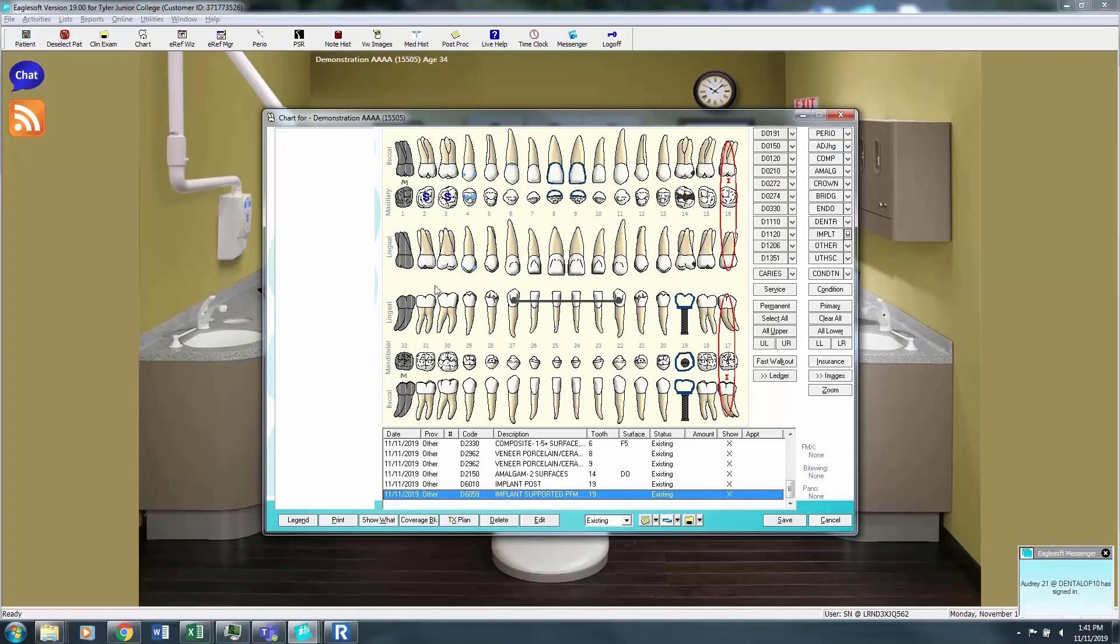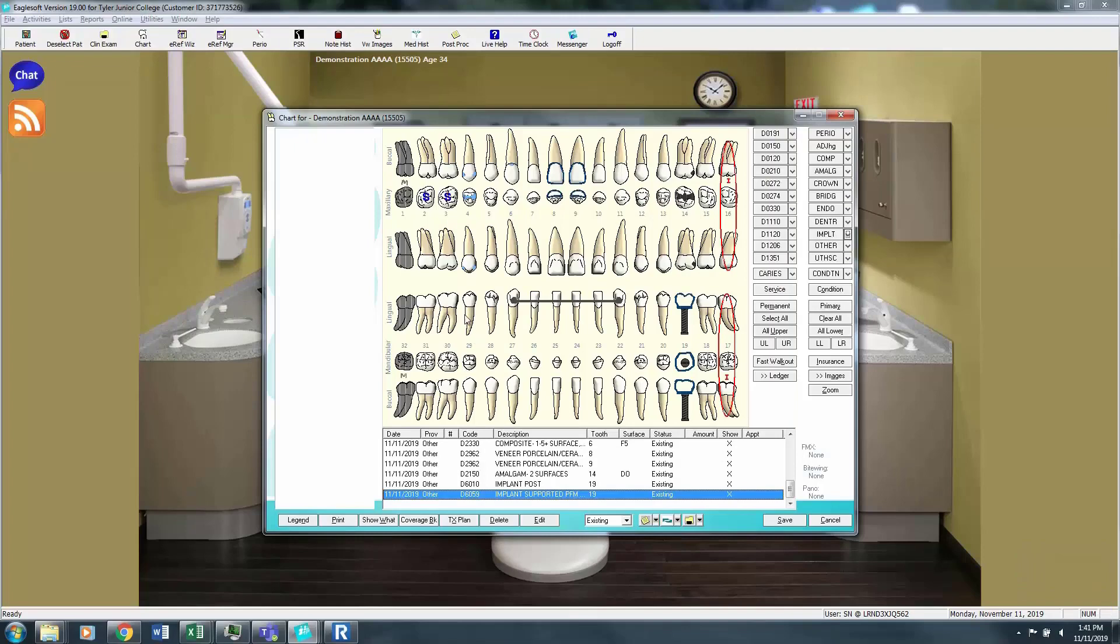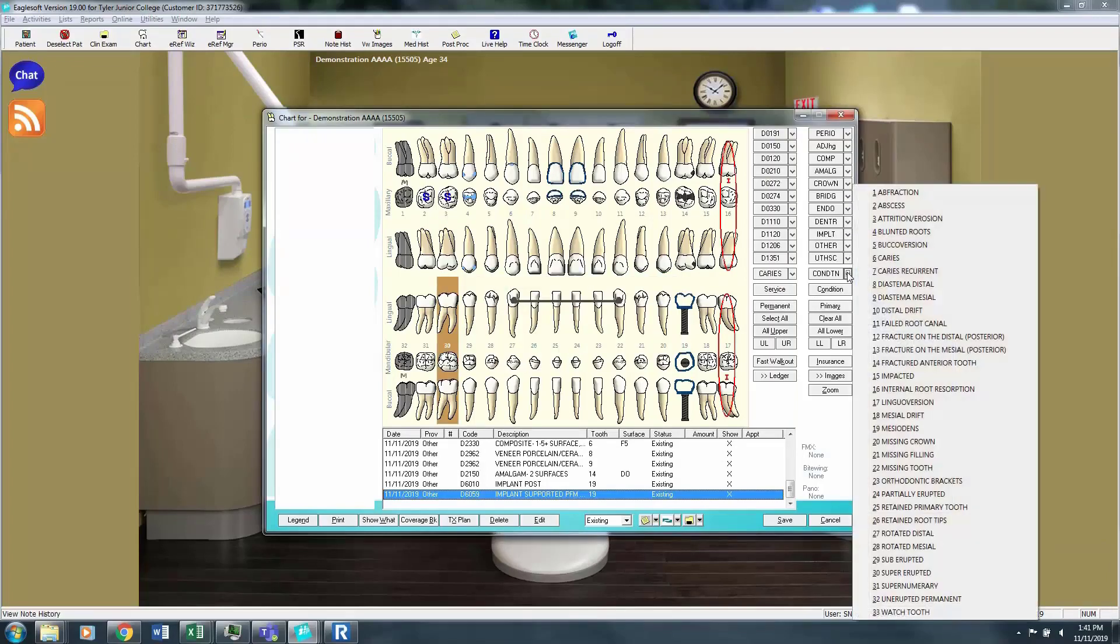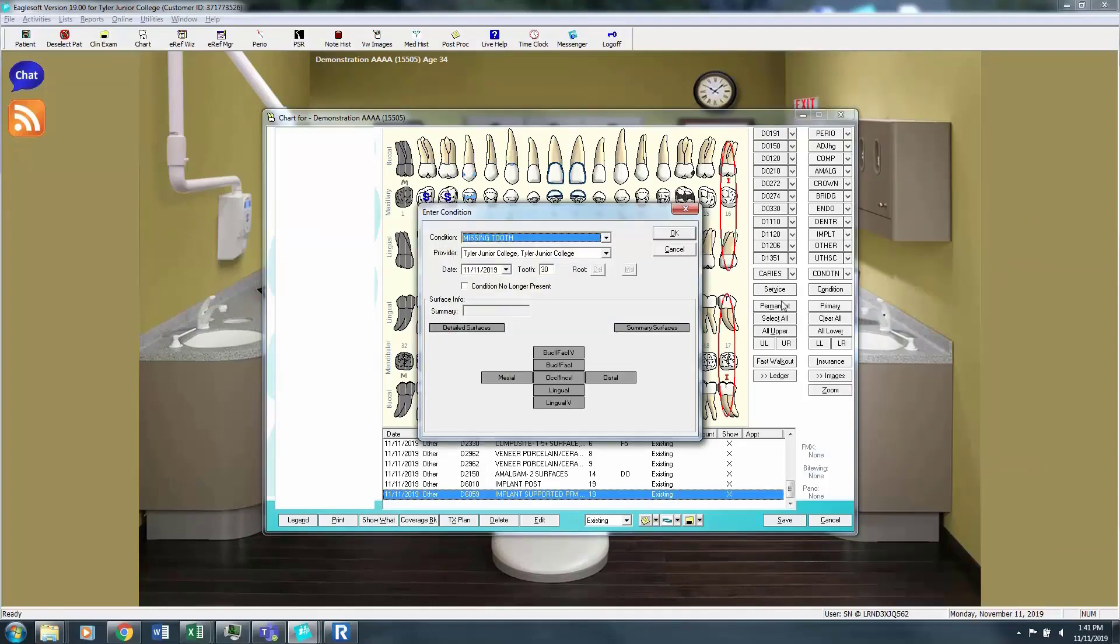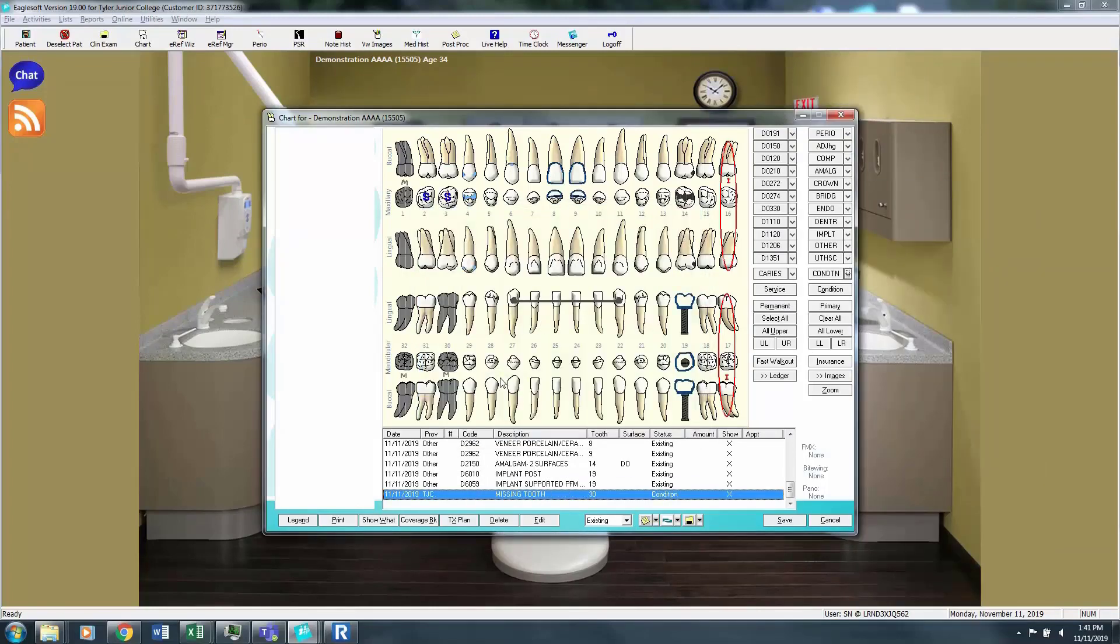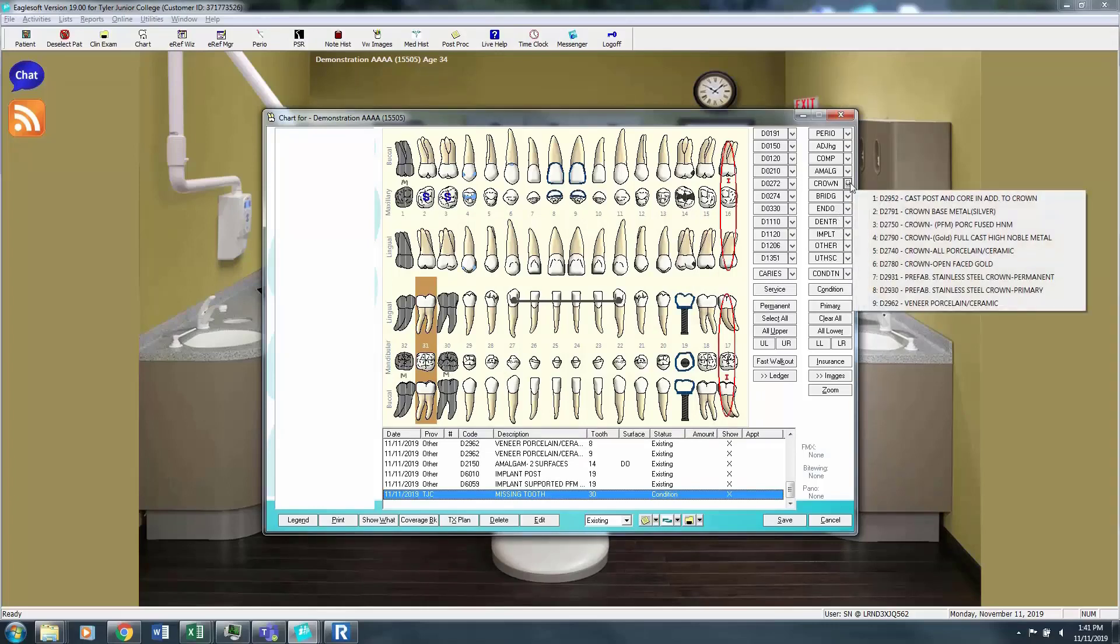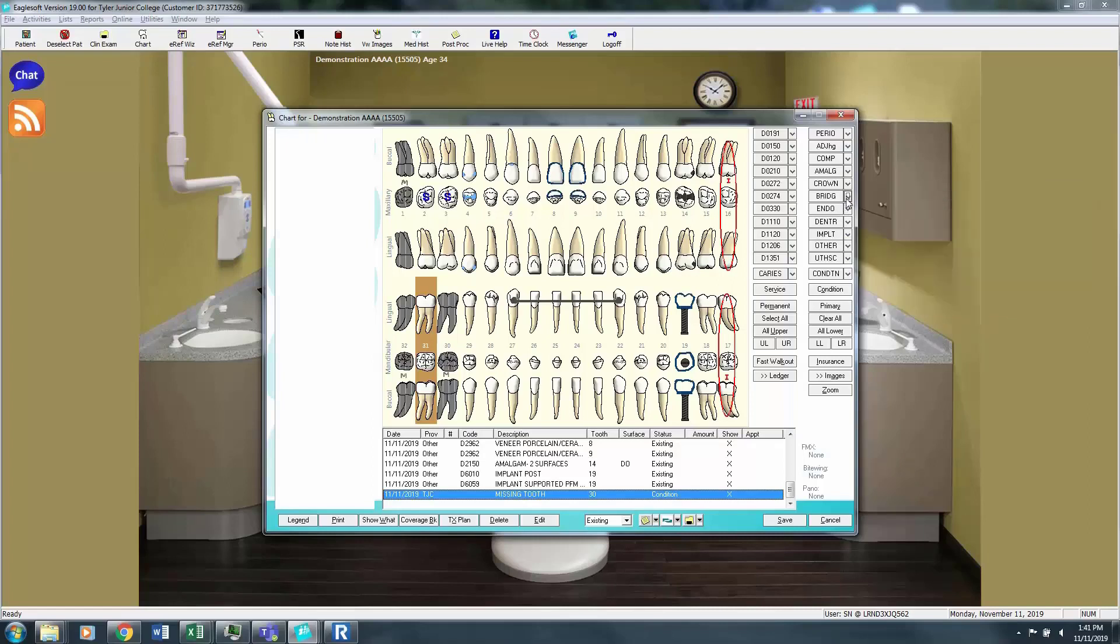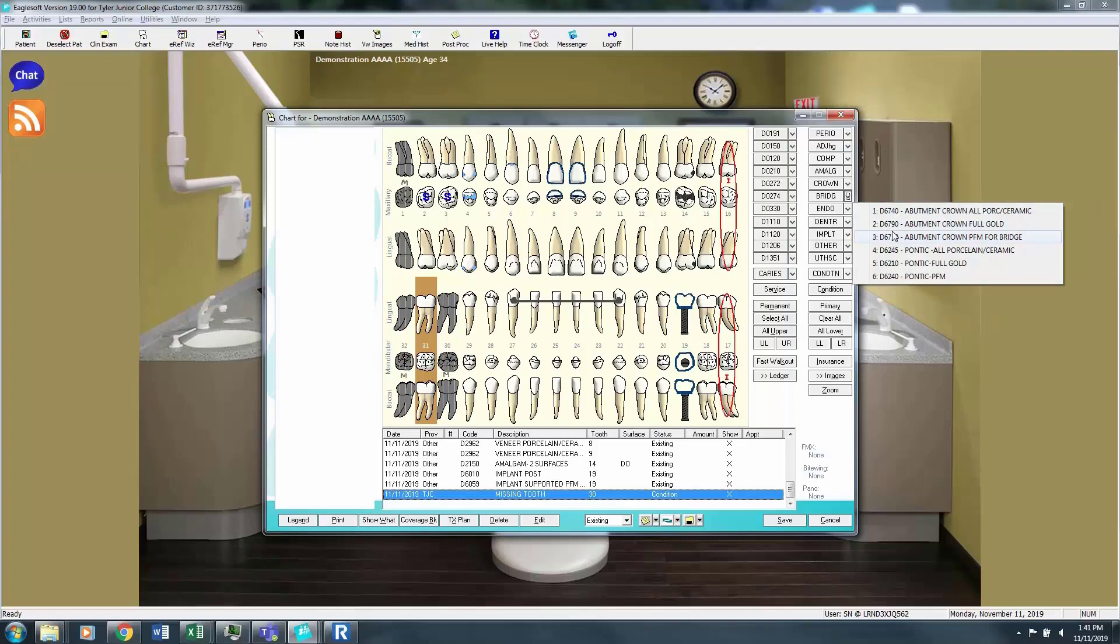Now in order to do a bridge, we're going to do a bridge here on the left side that can be a little trickier. We're going to take out number 30. So that tooth has been extracted. And we are going to crown. We're going to make abutment crowns for tooth number 31 and 29.